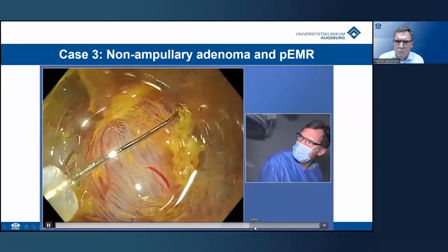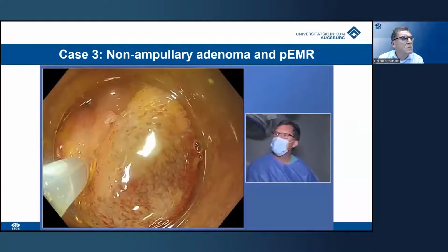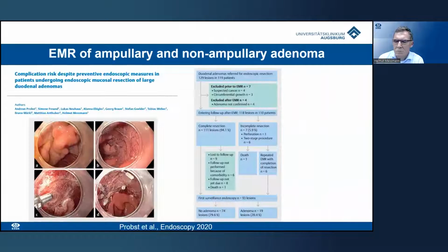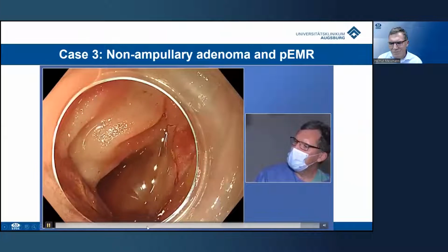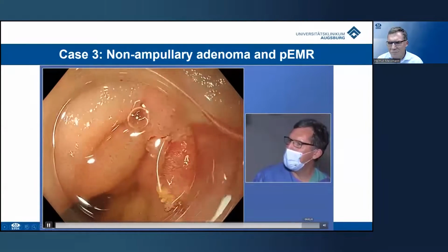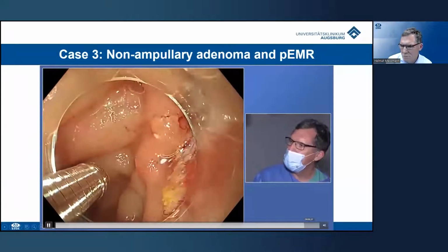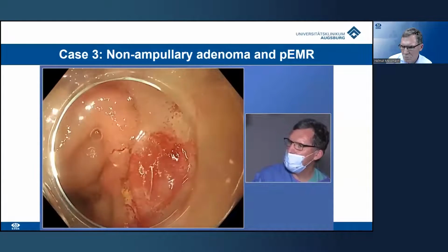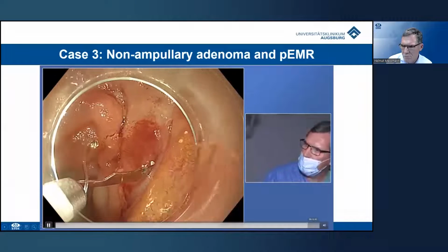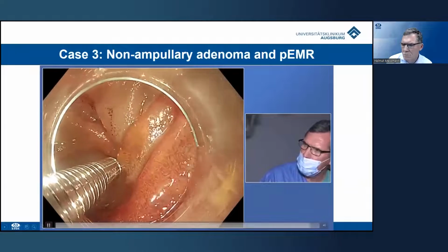Slowly close. Yes, close. So going to the end. It had a shape like a V. So there is in between a small area where we resected. I start here with the clip open. Close.